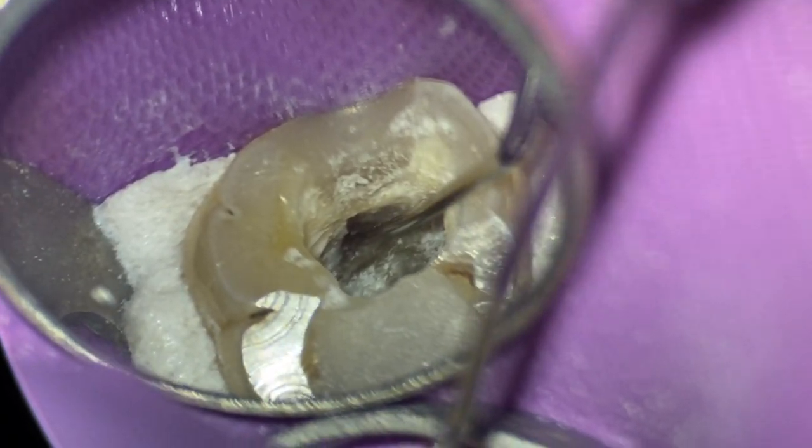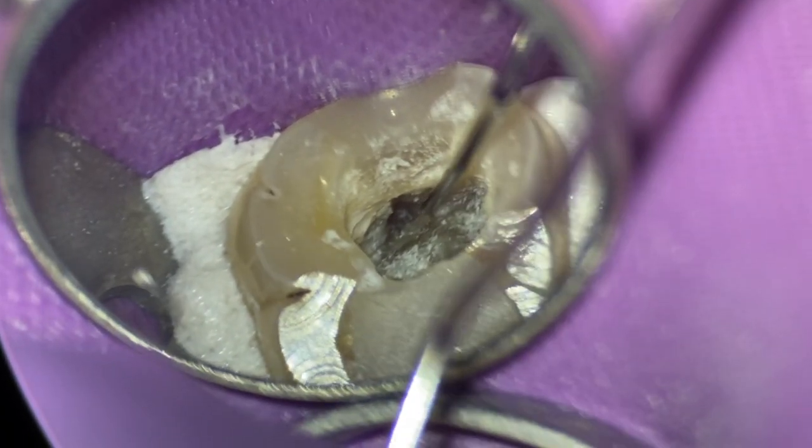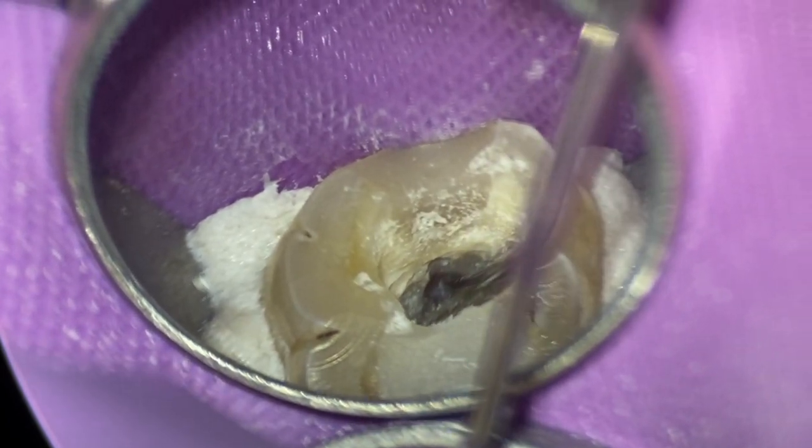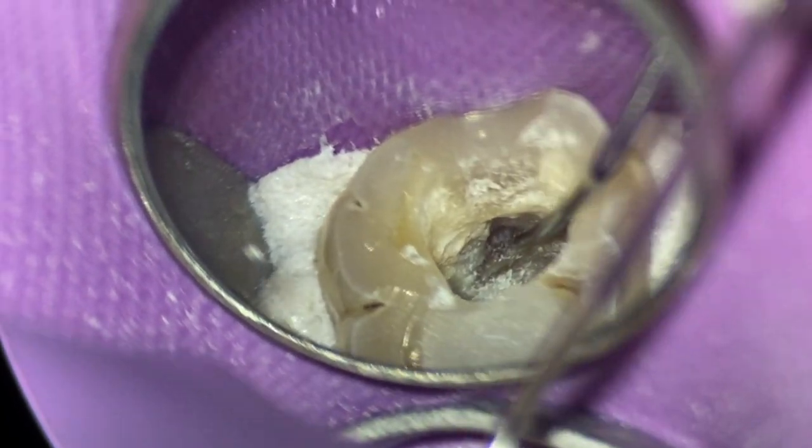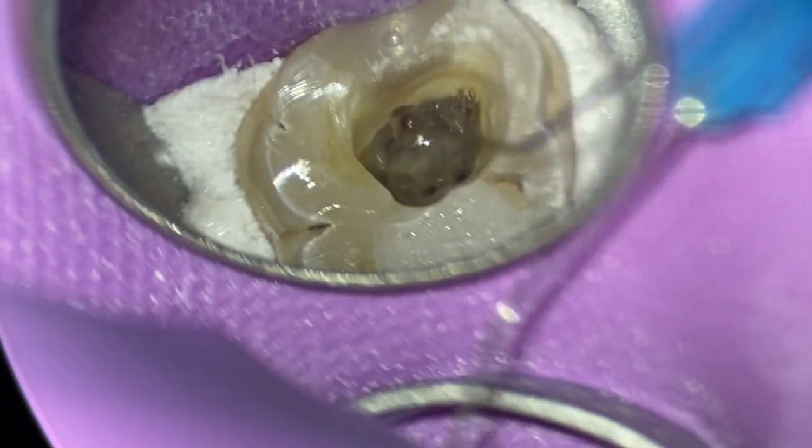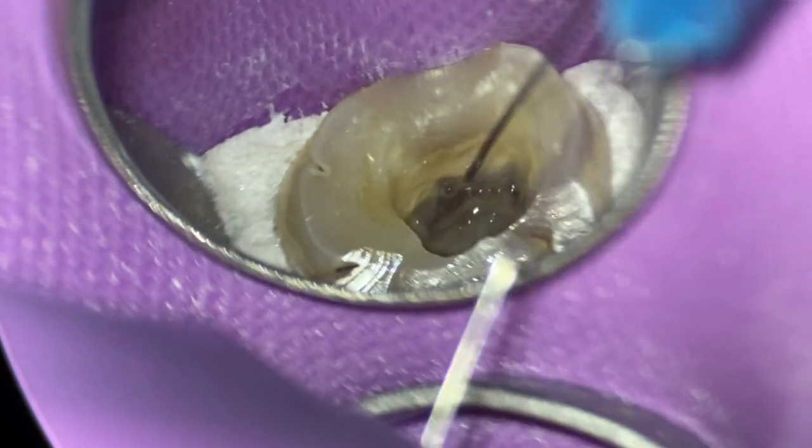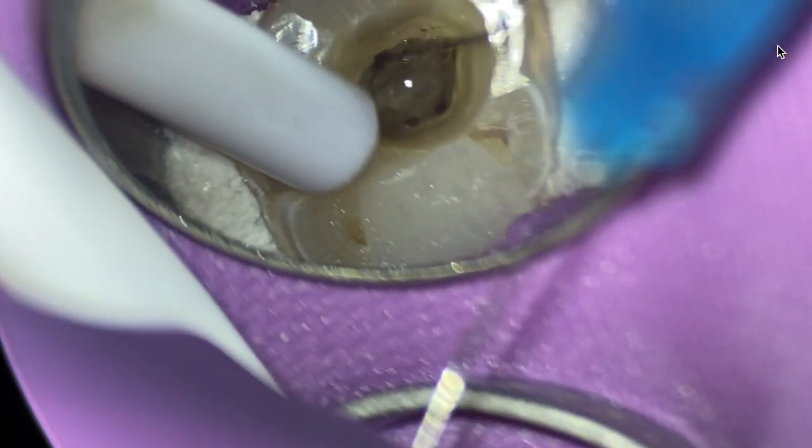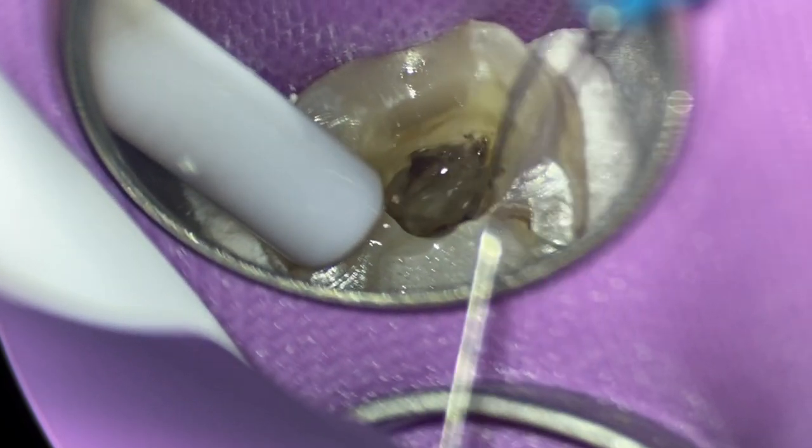MB2 normally, its normal course actually courses mesially and then apically, trying to tackle it right around here because that's its normal course. So I'm using still the half round burr. This might've actually been—I don't like ultrasonics at all because it's another machine I have to grab out, but ultrasonics might've been very useful in this case. You can see that hook. I'm just trying to sneak it into anything. There's that white dot again. Comes the endo explorer. I poke away and then it disappears again. I'm like, oh gosh. So we're poking, trying to get a stick. If you do endo, you know what I'm talking about, trying to get a stick in anything.